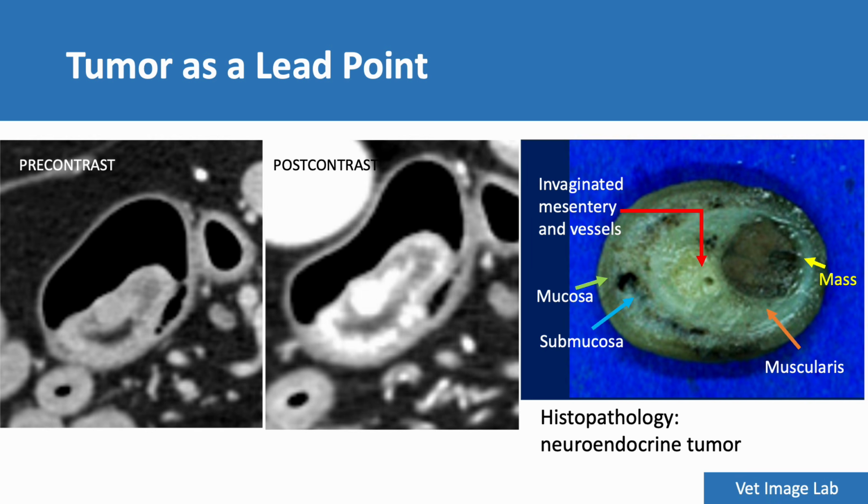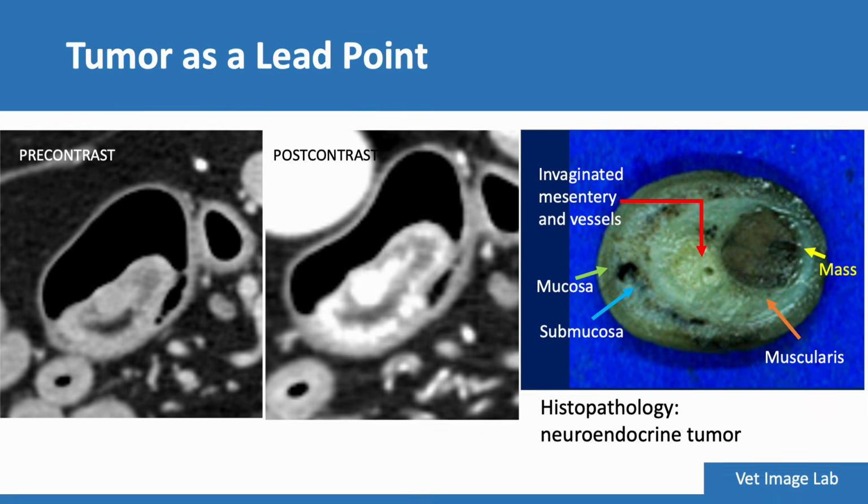So, when intussusception develops suddenly in an older animal, we should carefully search for an underlying cause. A detailed ultrasound evaluation is the first step, and if the underlying lesion is not clearly identified, computed tomography can be helpful for evaluating the involved bowel segment more precisely.